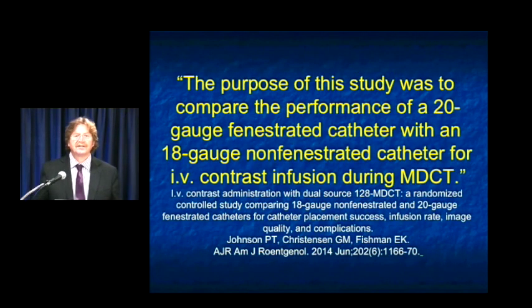Well, the good news is things have changed. There is a new needle that has come along by Becton Dickinson, the Nexiva needle. And what that is, is a fenestrated catheter, okay? What does that mean? Well, when you think about its typical needle, all IV needles are the same. Come in different colors, but they're the same. There's a hole at the bottom. And so you have an 18, you have a 20, 22, 24, even a 16. But there's a hole at the bottom, and the contrast shoots out the bottom. With this fenestrated catheter, it's kind of like a space shuttle. You have multiple side holes. So instead of everything going out through one hole, it goes out through multiple side holes.